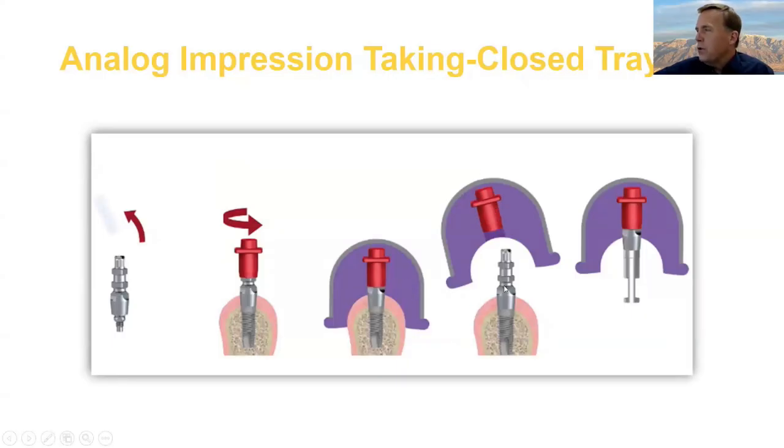Usually the impression material goes straight to the impression coping here. But anyhow, when you go to take one of these, pull the healing abutment, seat this, take a radiograph, that's the same. And then when you take the impression, you'll just inject your impression material all around the mouth like you normally would, over this, around here. You want to make sure we pick this up well, because this is an important index we'll talk about later.